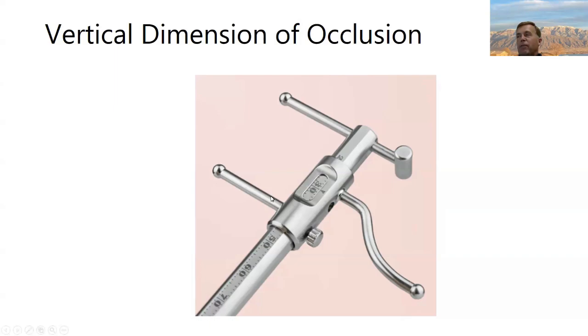Even with patients who have a good VDO, this can be an awesome tool because you can measure it and record it in the chart. And then as you're going through the process, you can take out this instrument and see how it's going. Make sure you're not gaining or losing VDO in the whole process. I would say this has taken dentures and All-on-X by storm. If you haven't had a procedure for measuring or validating VDO, I would consider adding this. It's pretty easy to use and it gives you something to start with.